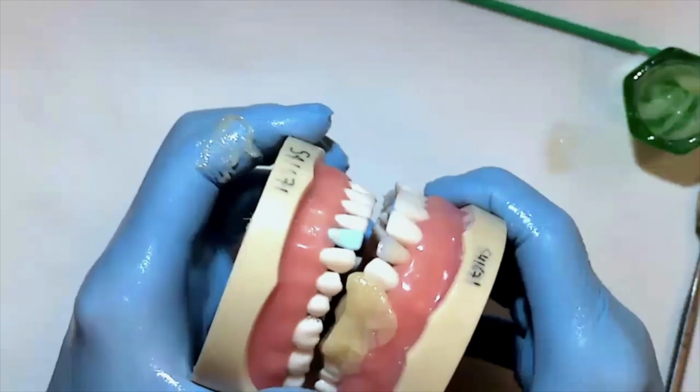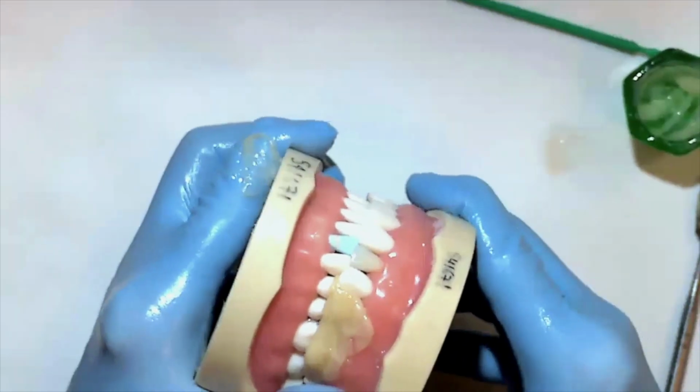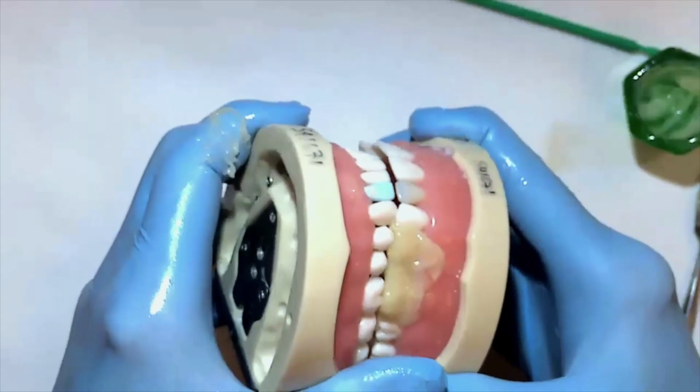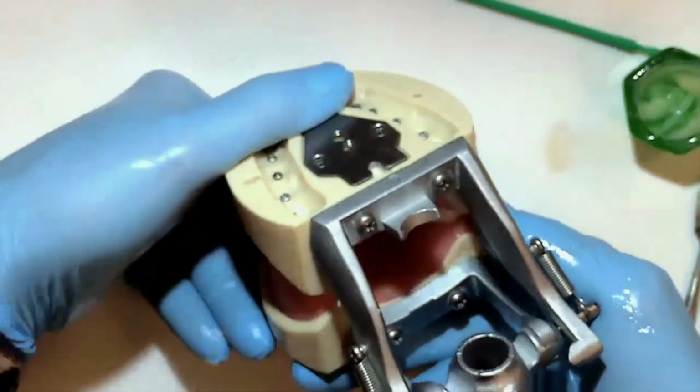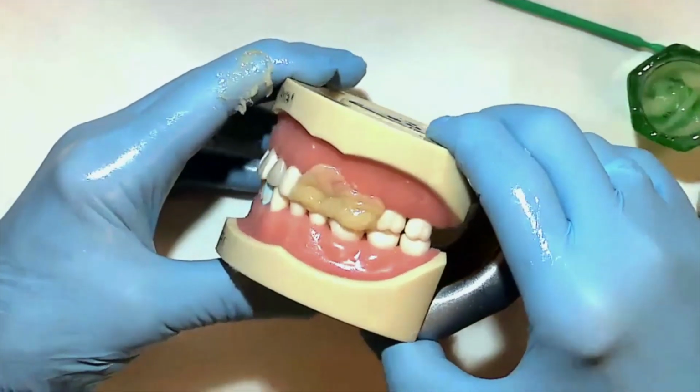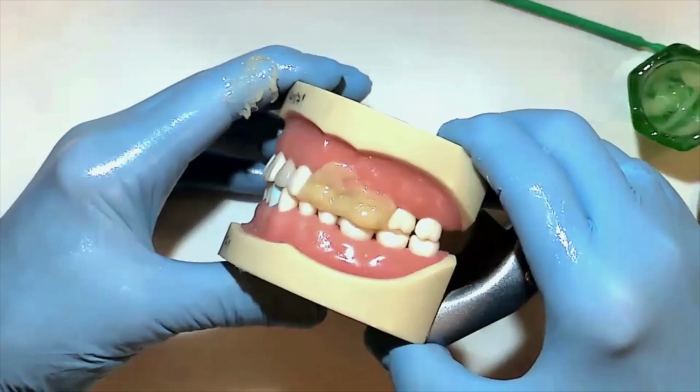Now we're going to close the articulator canine to canine and slide into maximum intercuspation. This will give us the inner inclines of the maxillary buccal cusp, and if we do it right, we will get some guidance on some teeth besides the canine.